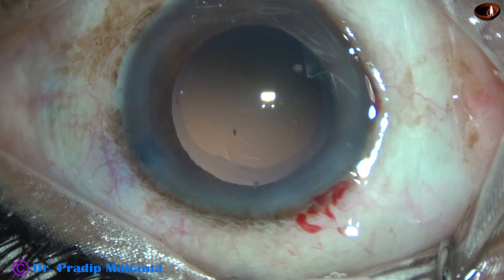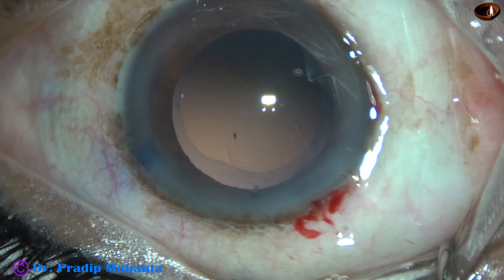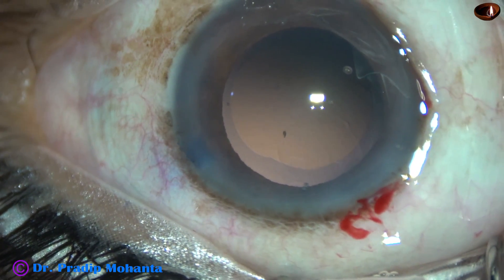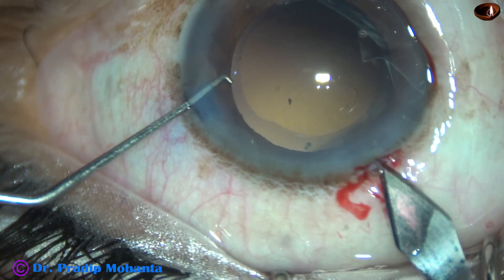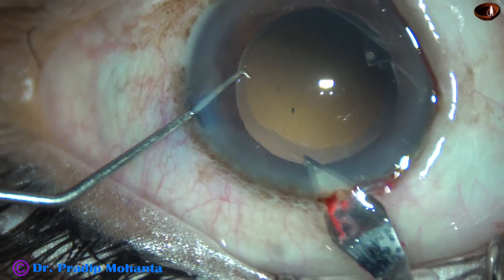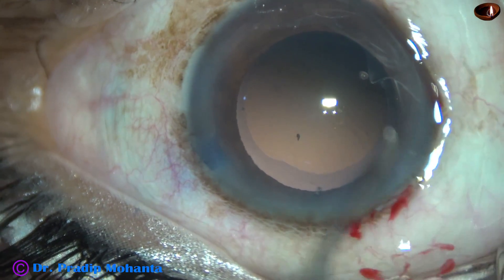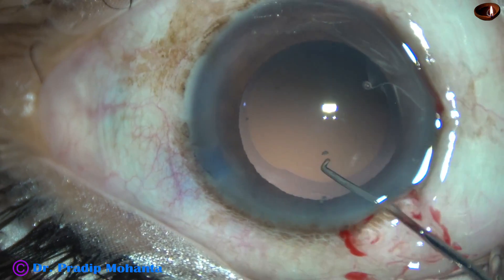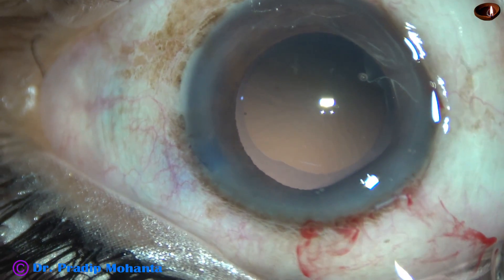Now we can see a black pigment-like thing in the anterior chamber. I am going to take that out. I enlarge the main wound to about 3.1 mm. Then I take a Sinski hook, depress the posterior lip of the main wound, and it comes out.